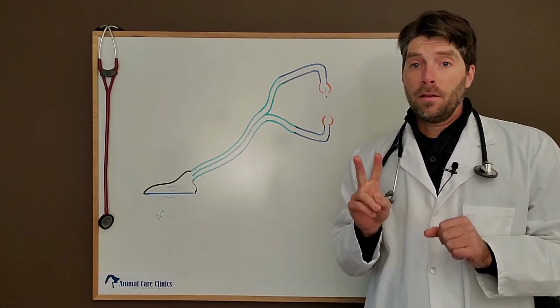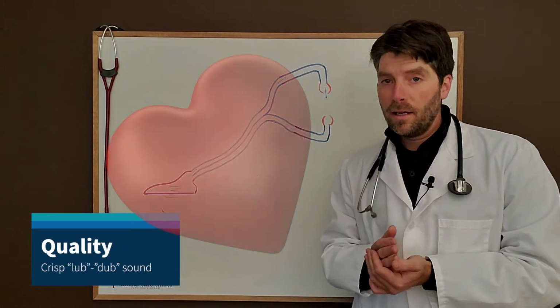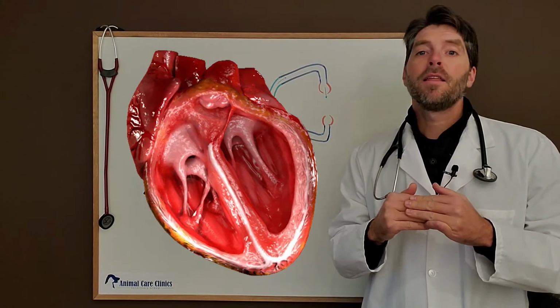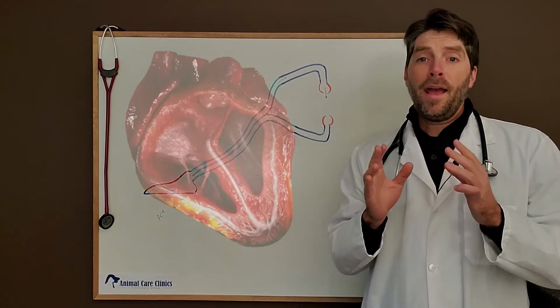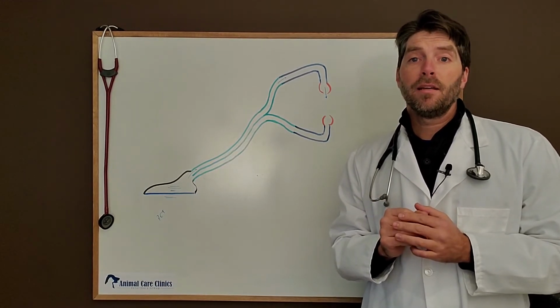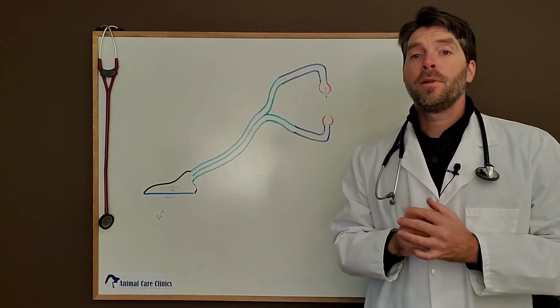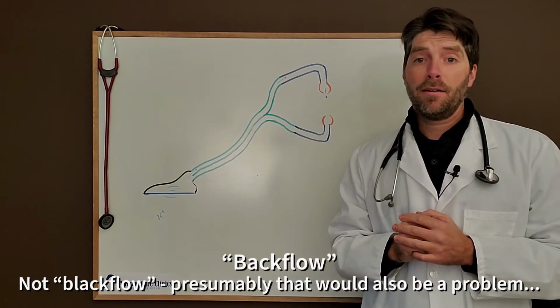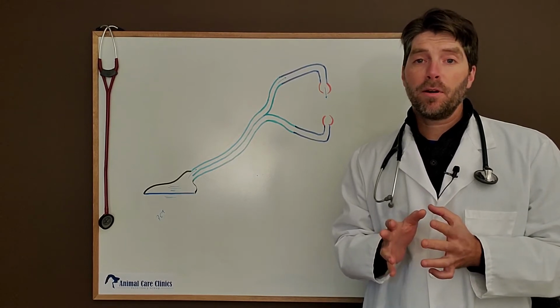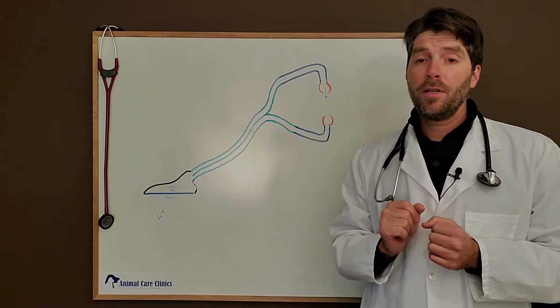So with the heartbeat, there are two sounds, and we want to hear a nice, crisp lub, dub. That is one beat. That's the heart valves opening and closing that make lub, dub. And those heart valves prevent the backflow of blood in the heart. So the blood is always moving one way, which is exactly what we want. If blood backflows in the heart, then we have a problem. The heart valves aren't sealing properly, and this can be a sign of heart disease. It's something we can often also hear with the stethoscope.